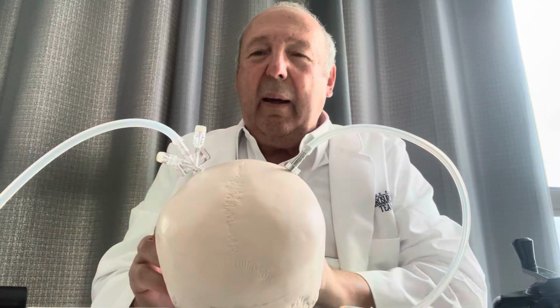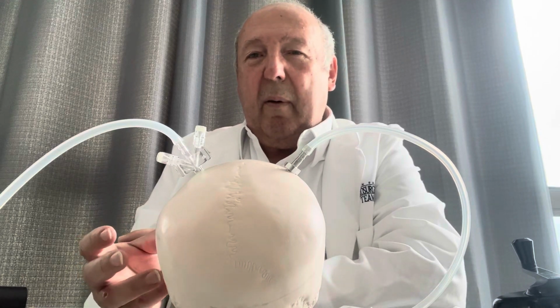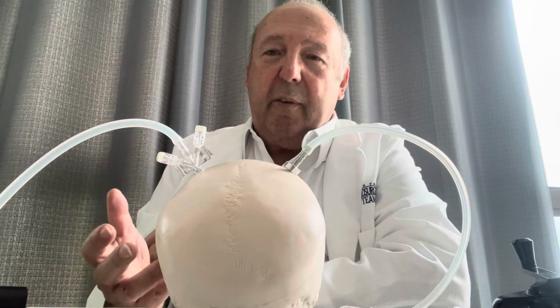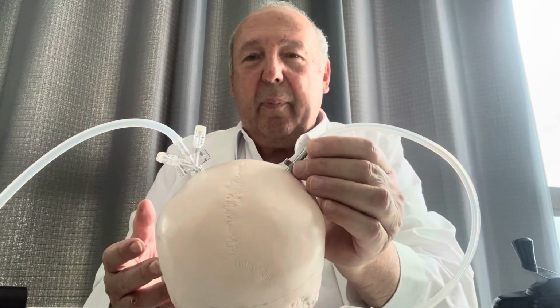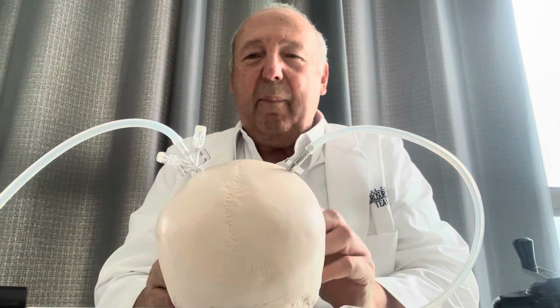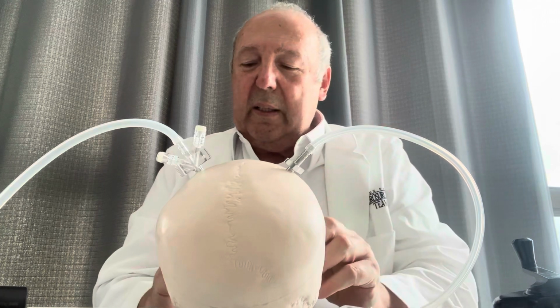The NASP being a plastic, it is compatible with the MRI, and during CT does not cause any artifacts, while the SEPS causes streak artifacts, and the patient cannot have an MRI if a SEPS is in place.